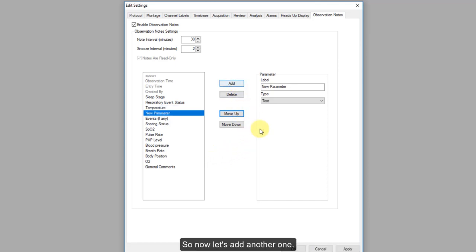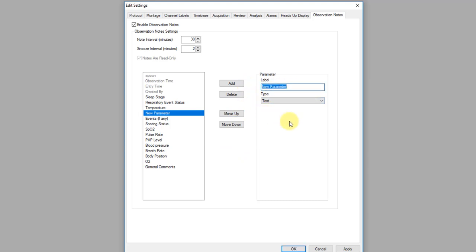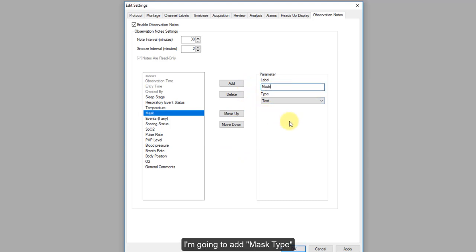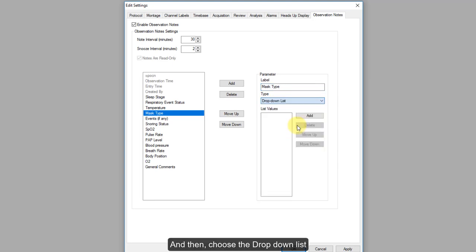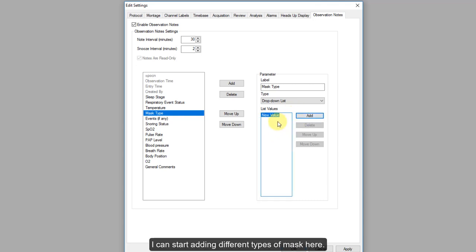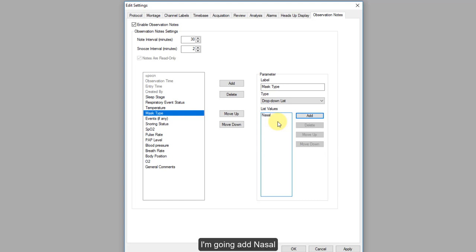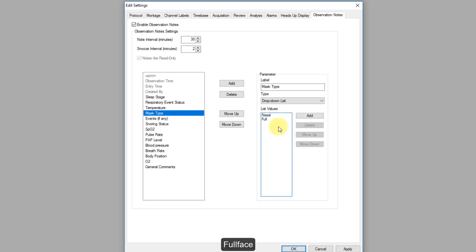Let's add another field — Mask Type. I can choose a drop-down list as the format type, then start adding different types of masks. I'm going to add Nasal, Full Face, and Nasal Pillow as options. Then click Apply.